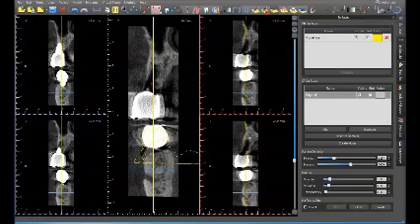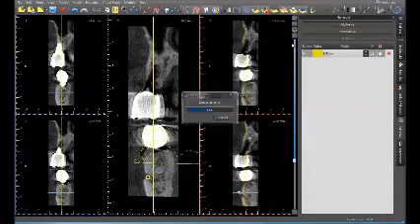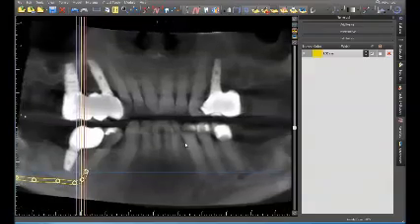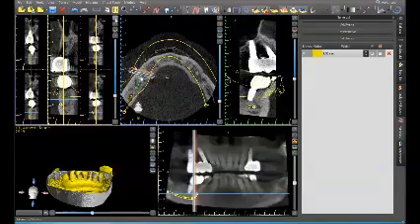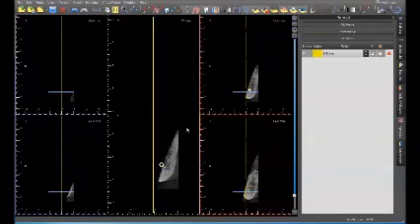So what we're going to do is press add nerve, detect nerve, click right here. It's going to automatically drop a nerve for us. I'm okay with that. This needs to be changed here and here. And then we can go back and check this in this view. That looks like it's pretty on point.